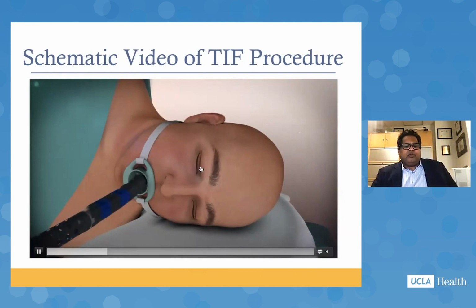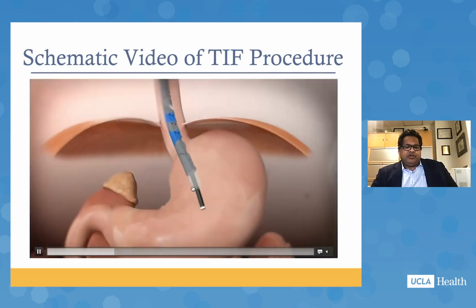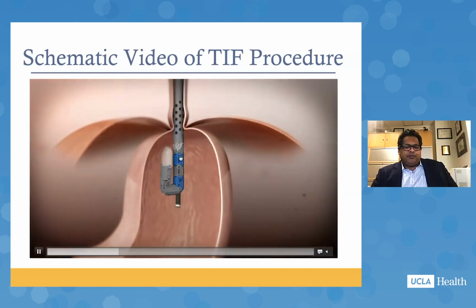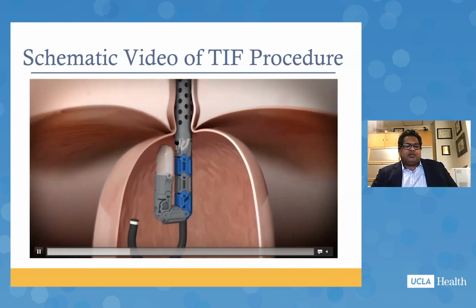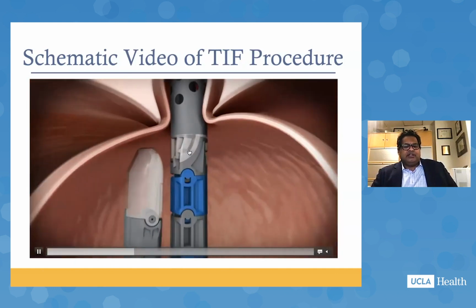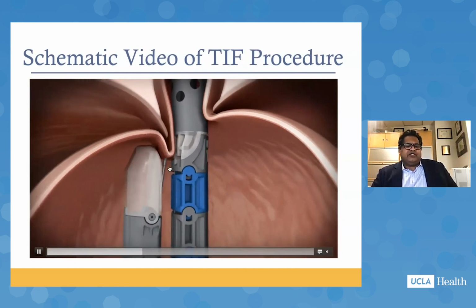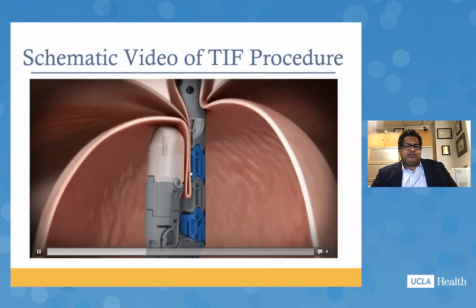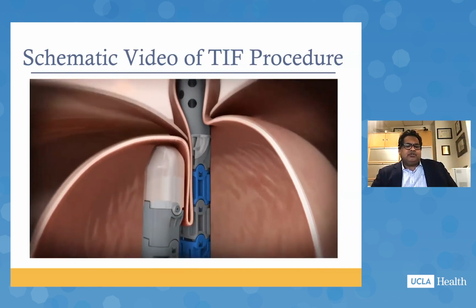You've passed this down. These patients are usually intubated. And then once you go down, you pull the scope back, and then there's actually a side hole you can come out, and then you can use the scope to help visualize and then perform the procedure. So you need 2 people to do it. One person holds the scope, one uses the device. And again, you can use the tissue grasper here, and then you bring it in and then close. And then this is how you create your plications.